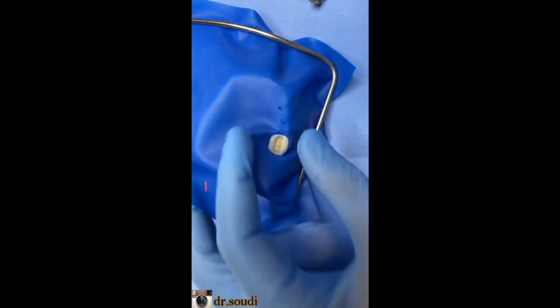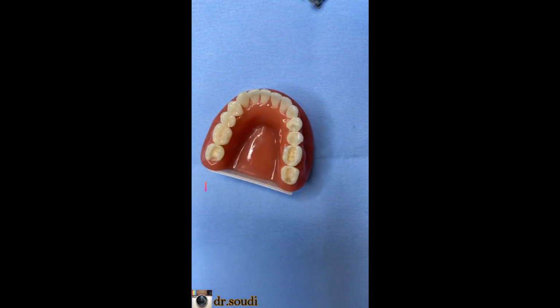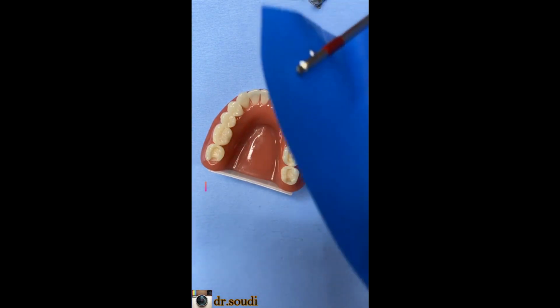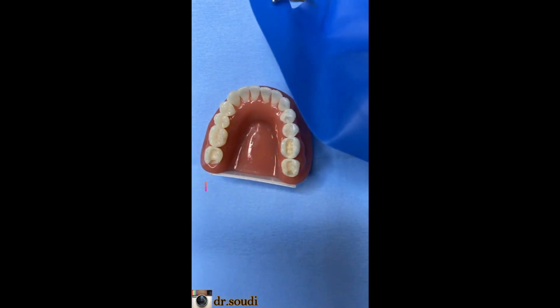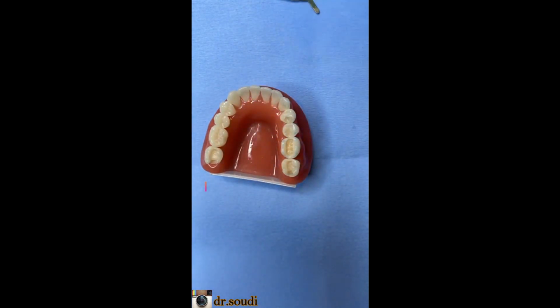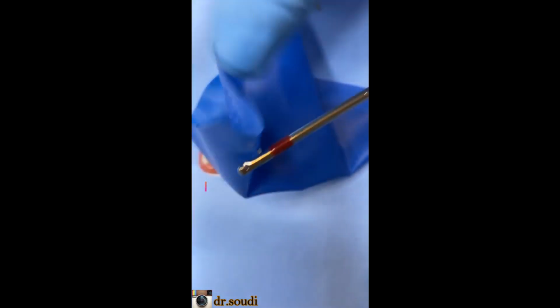Okay, if I have a patient with a large tongue or high gagging reflex, what should I do? There are 2 main techniques we can use, one with the wingless clamp and one with the winged clamp. Okay, first of all, you should remove the frame. We have the sheet now, and the 4 holes.